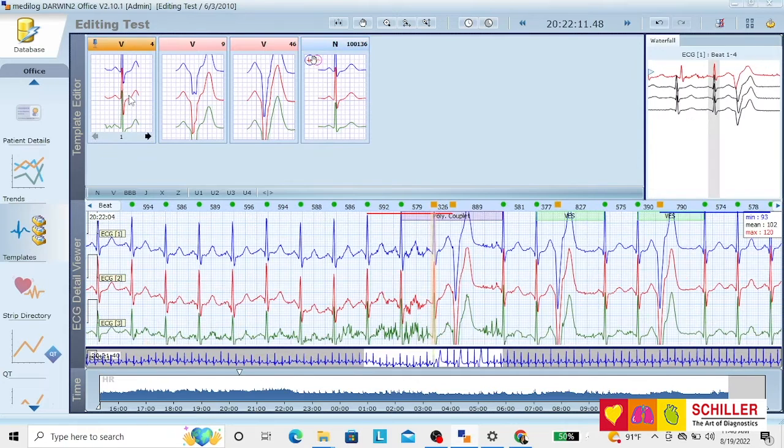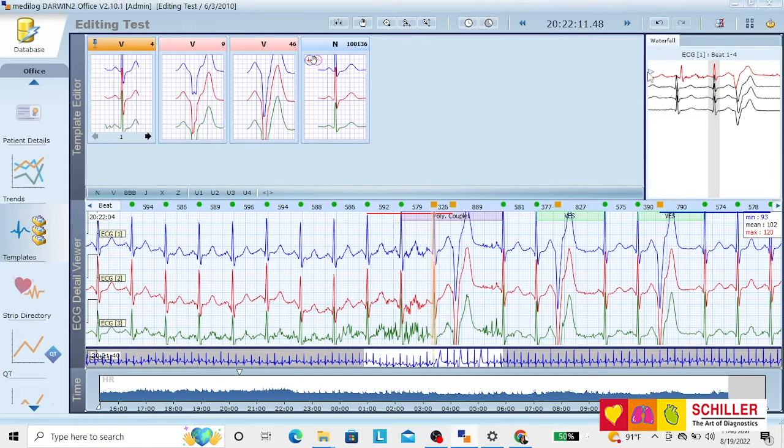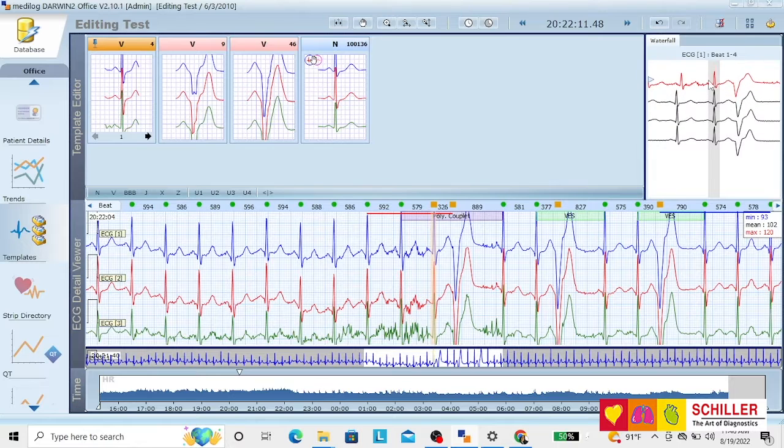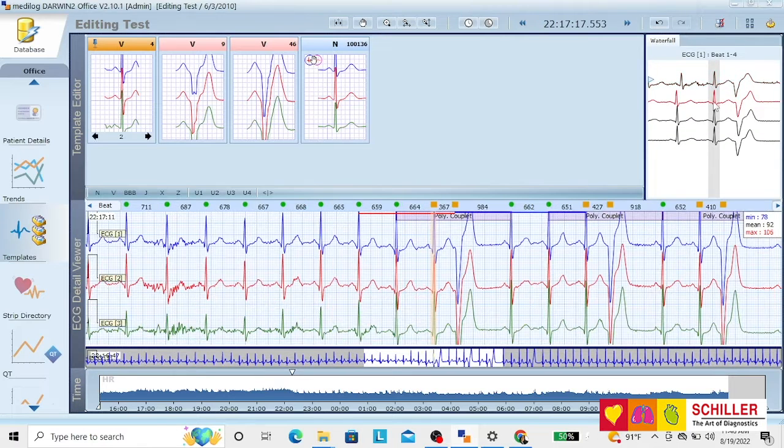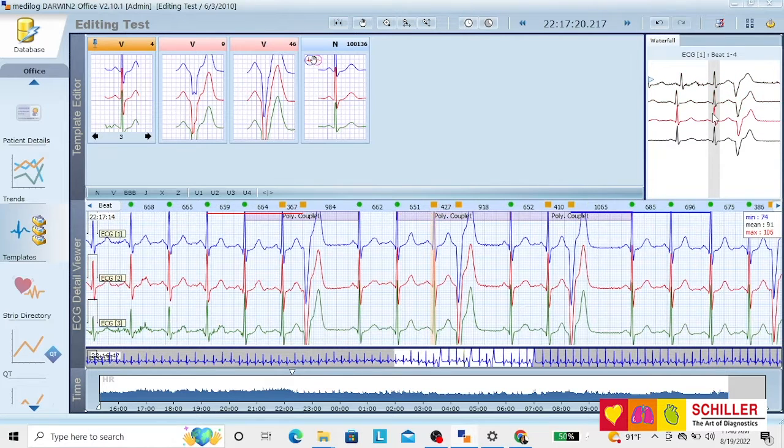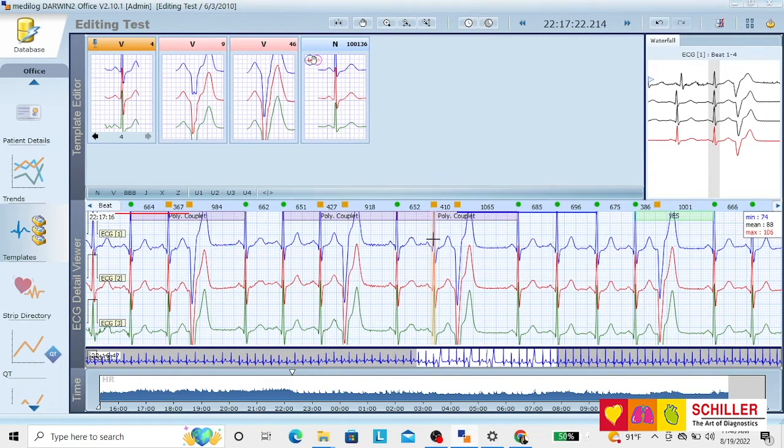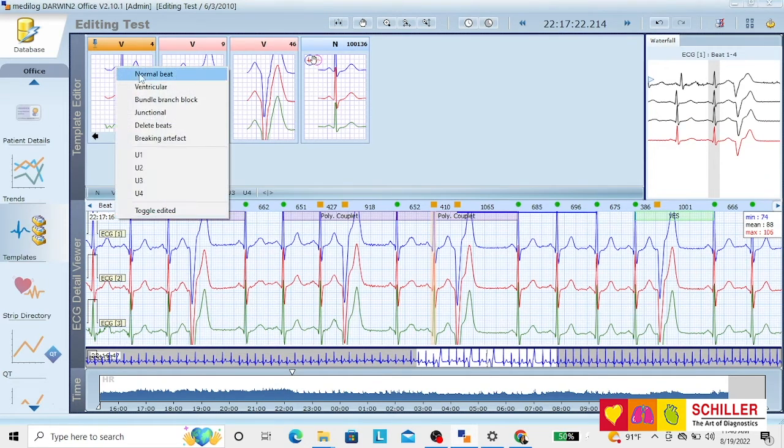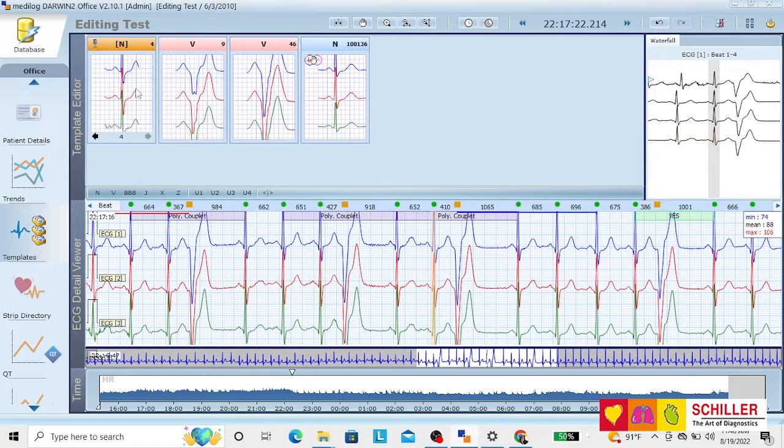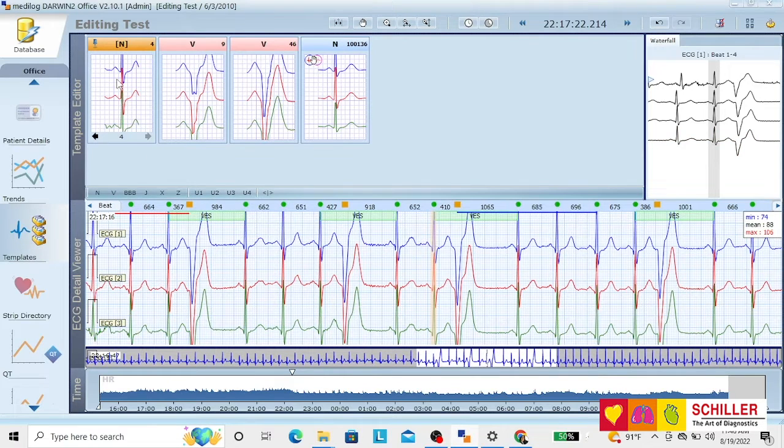Now let's go to the analysis of these ventriculars. We can see that these beats are really not ventricular. You can see the beat that's being analyzed. These are really normal beats. So we reclassify, right-click on the morphology, and reclassify everything.